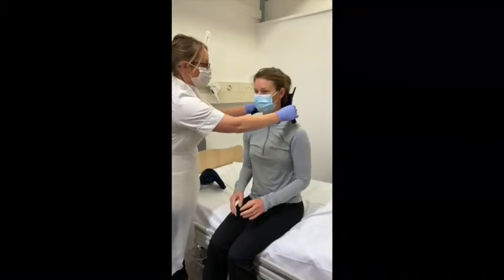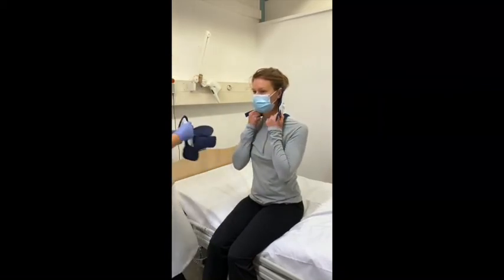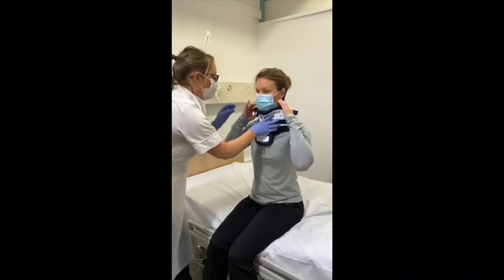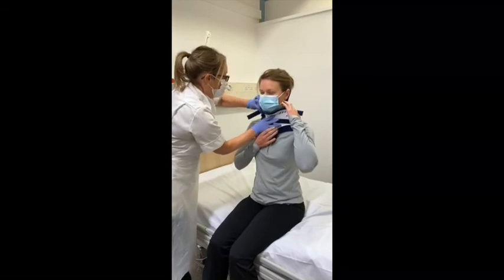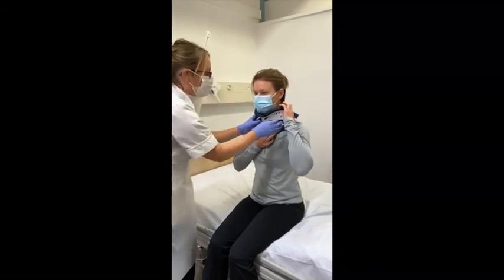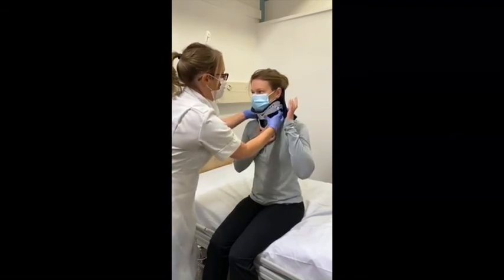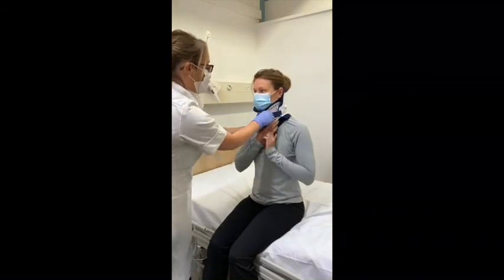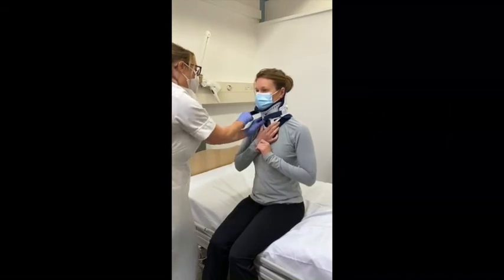To reapply the collar, ensure that it is the correct way up by looking at the writing or arrows on the panel. Place the back piece around the neck, making sure that it is centered evenly. Attach the back straps loosely to the front piece, ensuring that the chin is sitting on top of the chin rest. Then hold the front piece securely and curl the sides around the patient's neck. Alternately tighten the straps one at a time until they are in the original position and even on both sides.